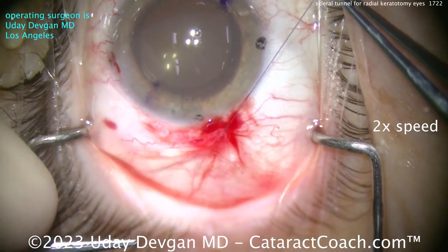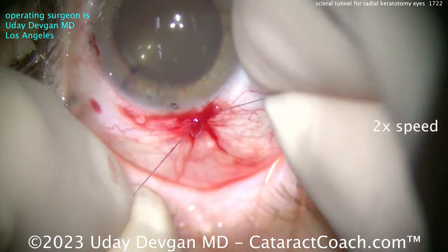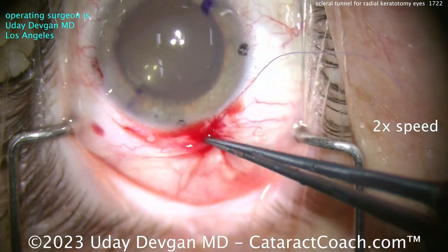Here we go tying this suture down — we'll call this case done. Beautiful case here. I hope you learned something, and for sure, you've got to know how to do a scleral tunnel.